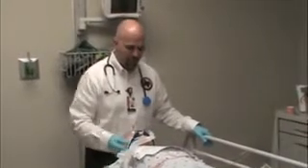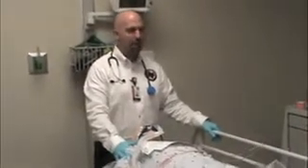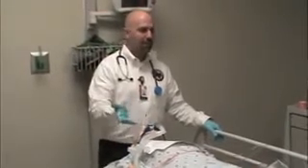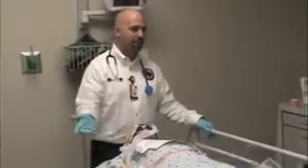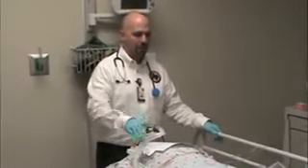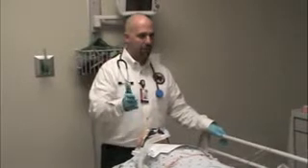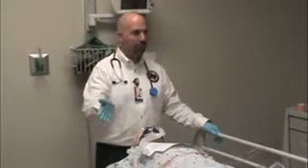The next thing is pneumothorax. If you have high pressure alarms on the ventilator and you don't have good lung sounds, then one of the things that you may have encountered is the patient's developing a pneumothorax. So if you see one side of the chest rising and not the other side, that's an indication that it's either a pneumo or the tube is pushed too far down one side.